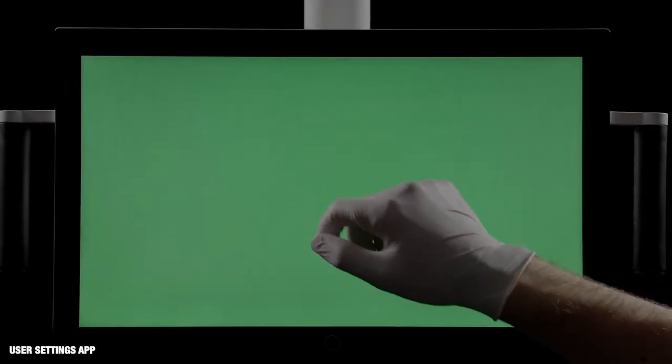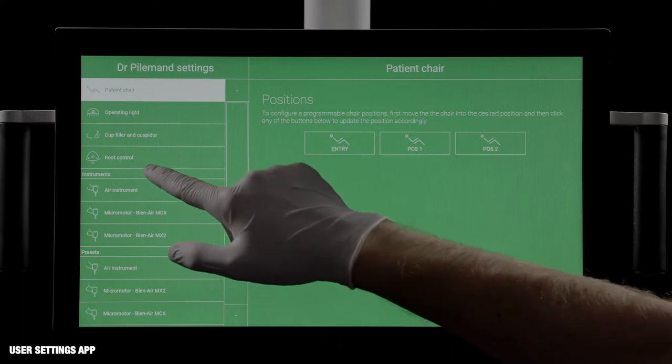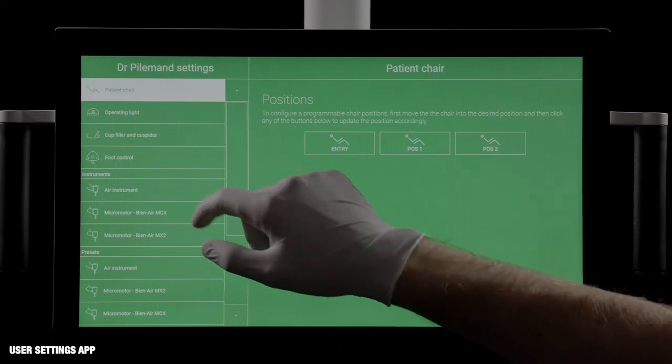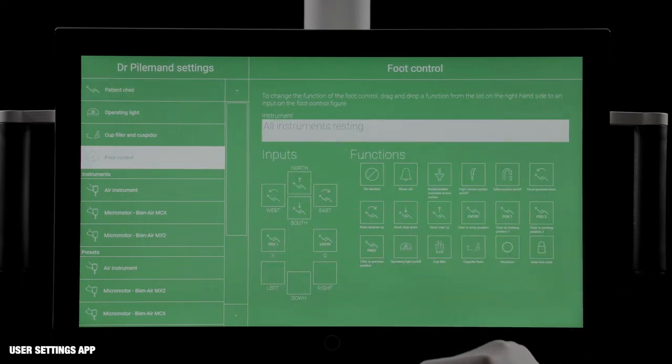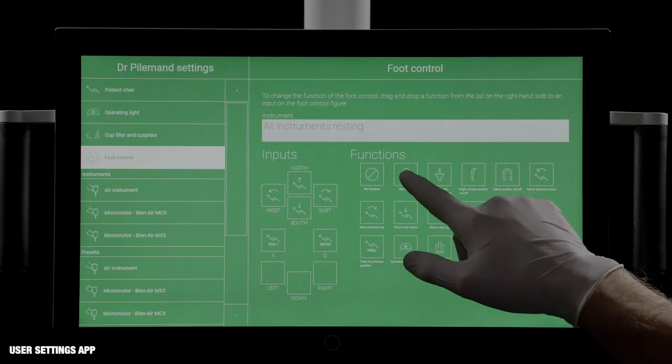The User Setting app is used to configure the individual settings. To configure the foot control, for example, drag and drop a function to the designated button.